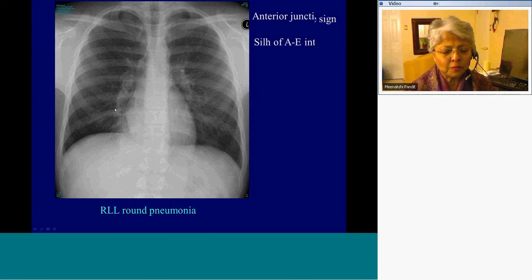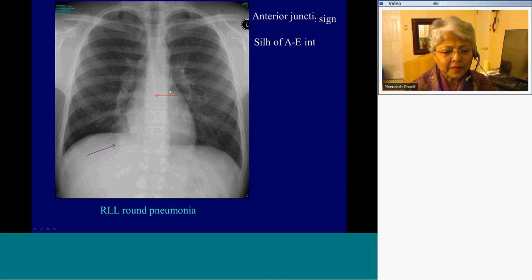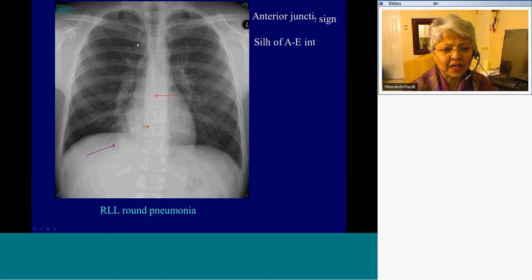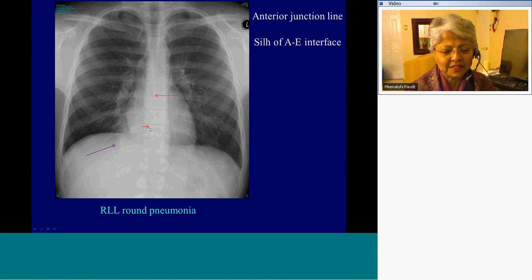This has abnormal opacity in the right basal region. If you compare the two posterior basal segments in the paraspinal regions, the right side is clearly denser than the left side. And if you look at the azygoesophageal interface, you cannot trace it above a certain point. What you're seeing here is the anterior junction line, where the anterior right and left upper lobes come together. This is where the azygoesophageal interface stops, and that corroborates our suspicion for a right lower lobe consolidation — it's a right lower lobe pneumonia.